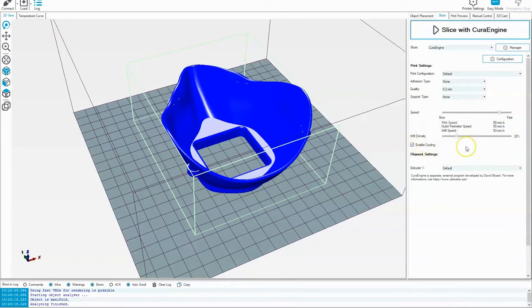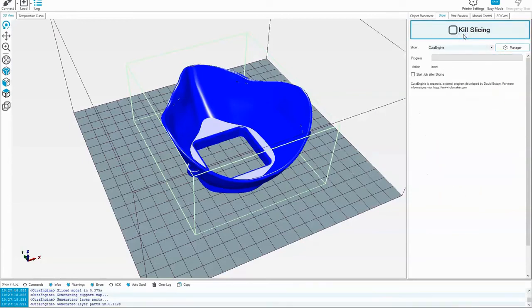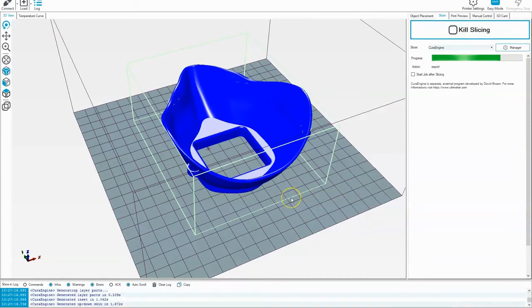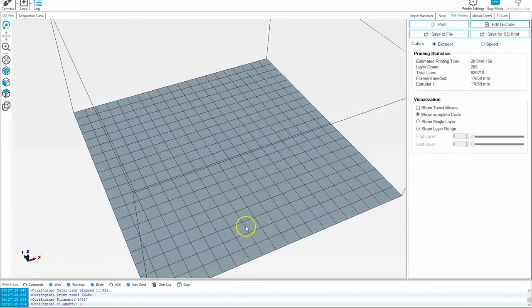Enable cooling so the fan turns on. And the extruder is running the default print configurations and filament settings. So we're all set here. We're good to go. I'm going to hit slice with Cura Engine. Now this is taking the solid object and turning it into a series of layers that will then be laid down with the print nozzle as the printer is working.